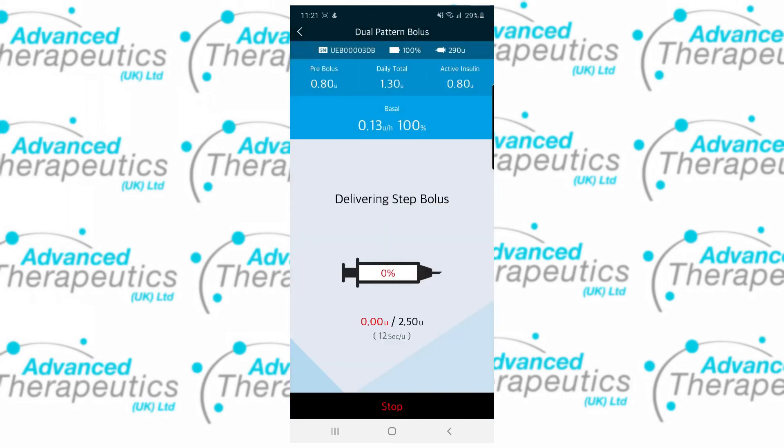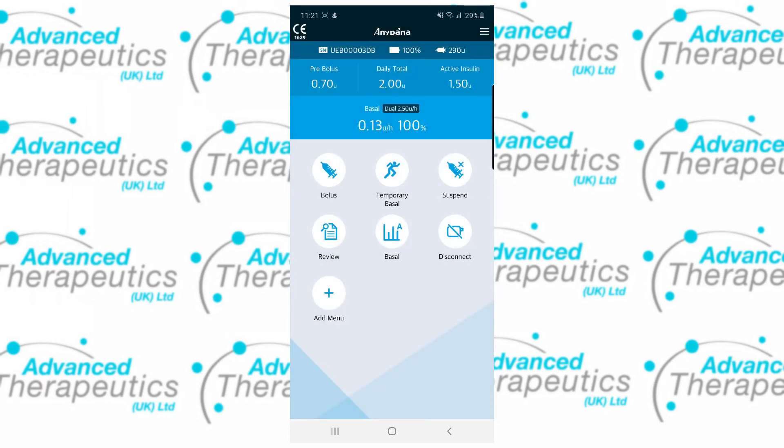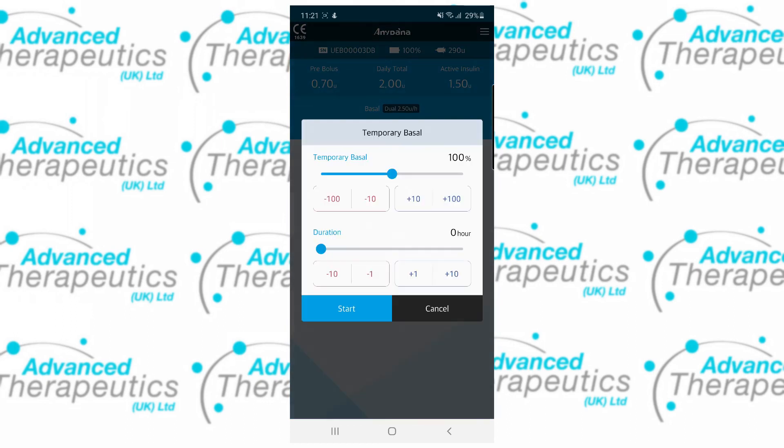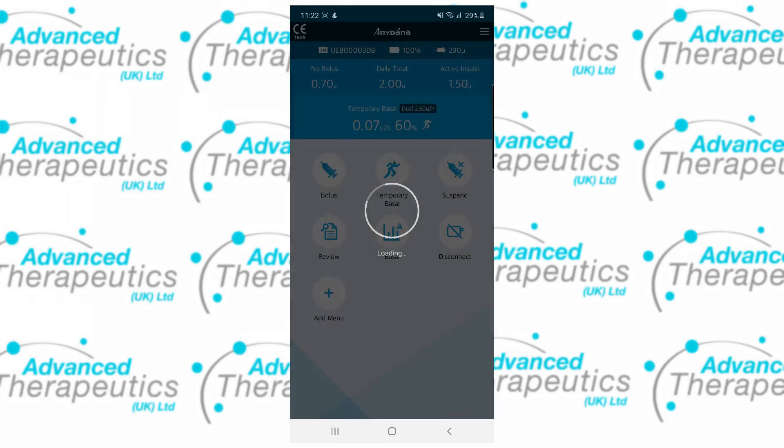At any point you can interrupt the bolus as it's being delivered, and your boluses are reflected on the home screen, showing you that you've got a dual pattern bolus being delivered right now. Temporary basals are really easy, with a percentage rate of 0 to 200%. You can choose your percentage reduction or increase as well as the duration for the temporary basal, all the way up to 24 hours. Once again you can see this change reflected on the home screen, with both the percentage indicating as well as the symbol for temporary basals appearing.